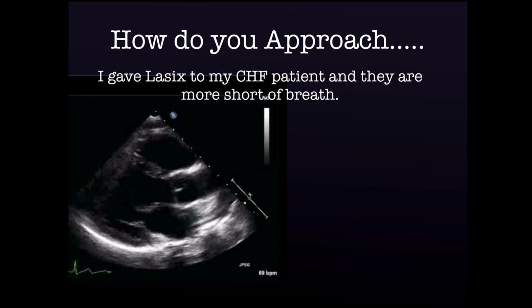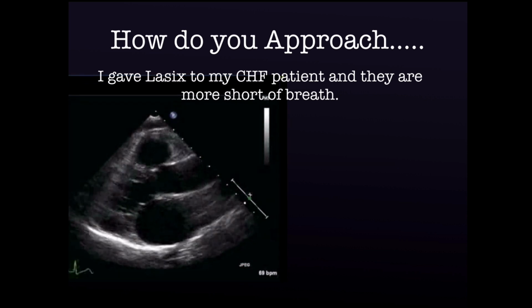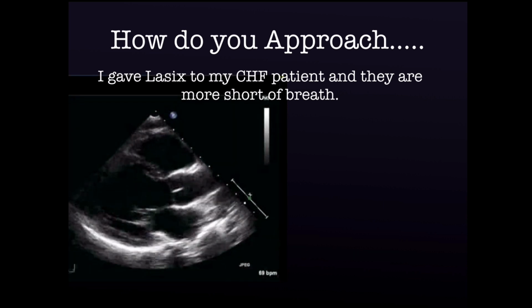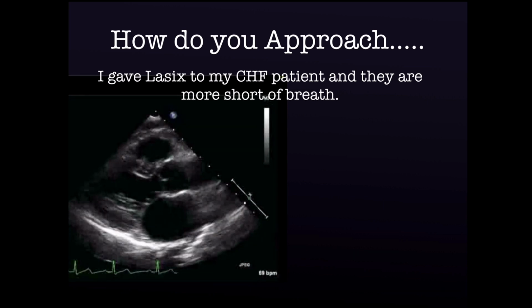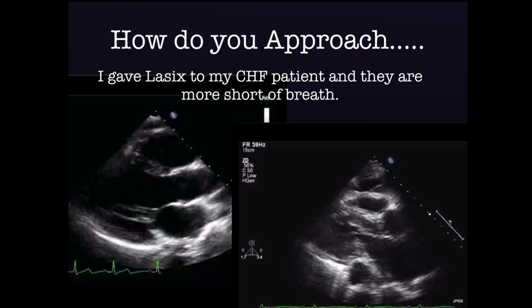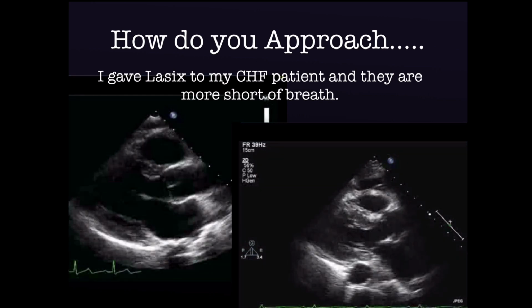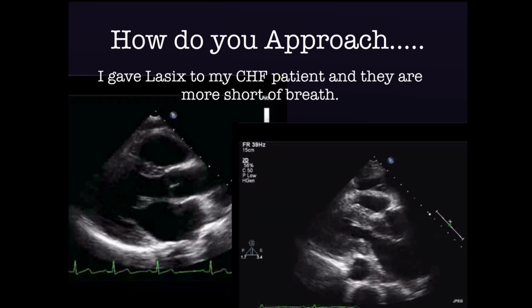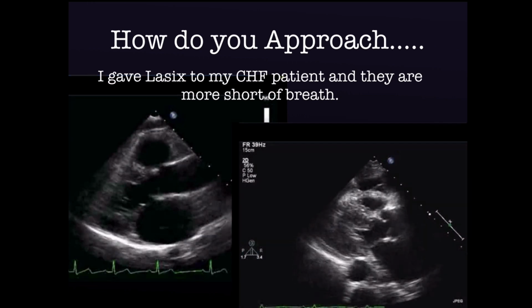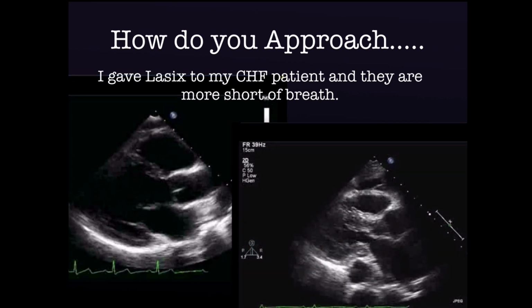So I can look at the ventricles, and I can see that there's active relaxation of the left ventricle. So it's pulling blood in. But if the heart has to hypertrophy because the systolic blood pressure is high over a long period of time and gets real thick, then it can't fill with blood. So it's not actively pulling blood in, and so it's having to passively fill that thickened chamber.